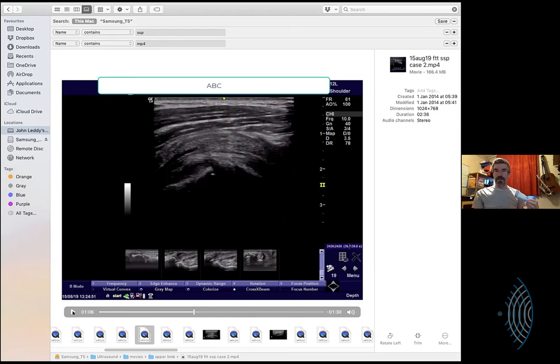Very good. And I pull it up like that in the direction the muscle goes. Yes. And we get a perfect scan through supraspinatus. And you turn the probe round to that grid, and then you get your long section. And you roll it round the greater tuberosity, and you've got a perfect scan.